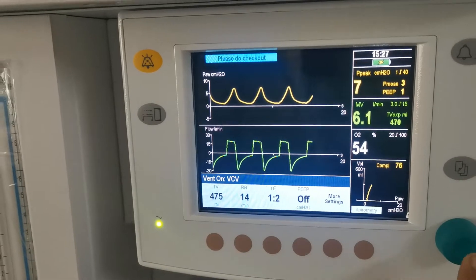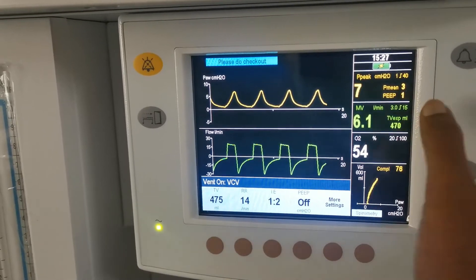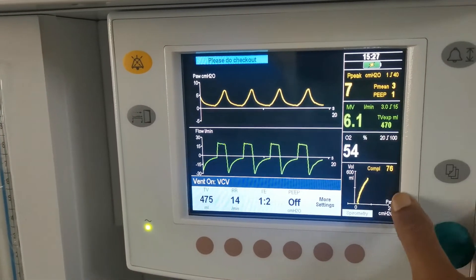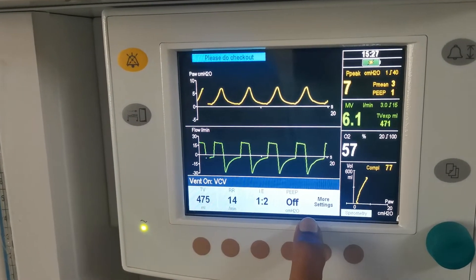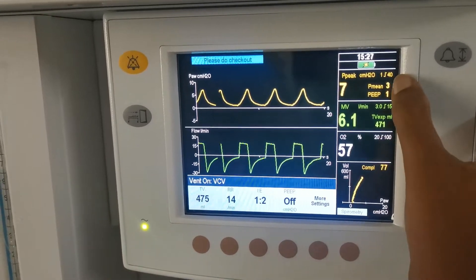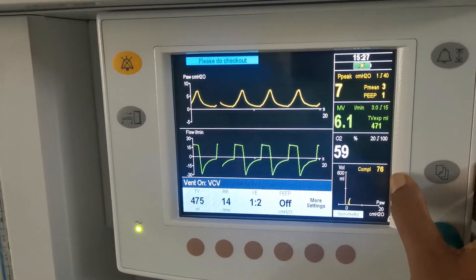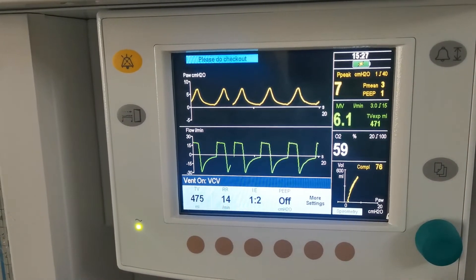Press it once and it will be selected. These are all set values — what we are setting. And these are all measured values — what we are getting from the patient.